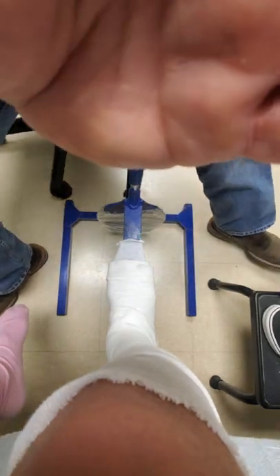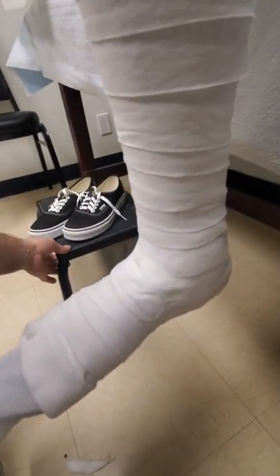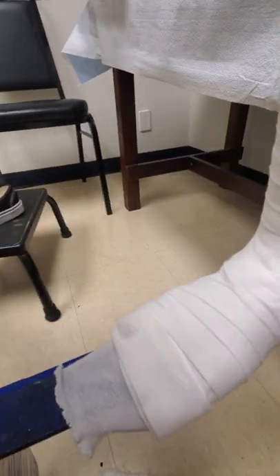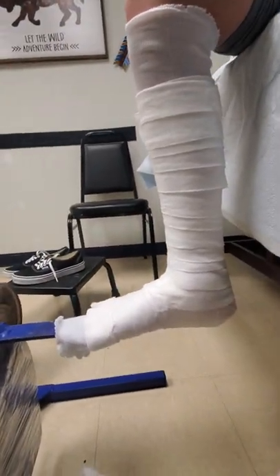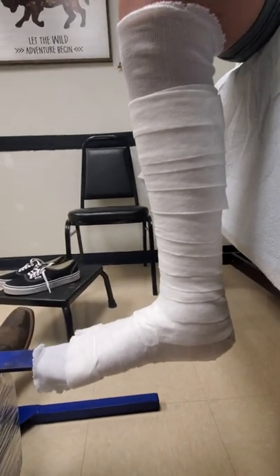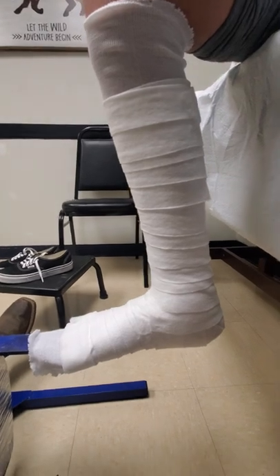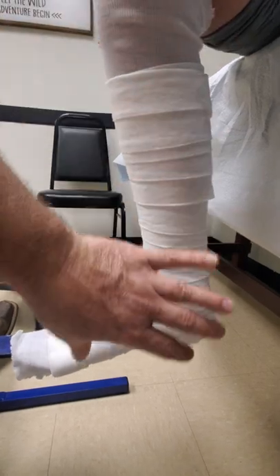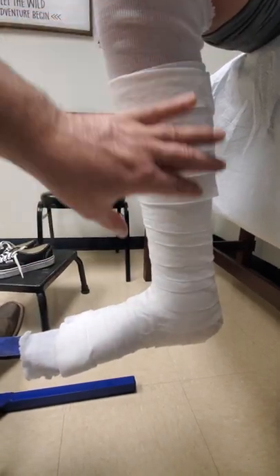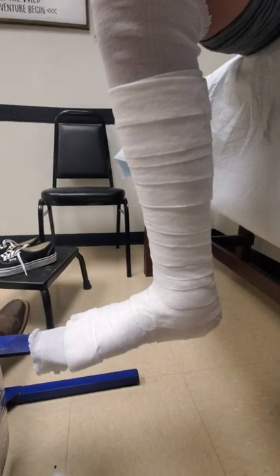I'm going to borrow the camera for a second to show the angle, which hasn't moved at all. We're pretty much there. I'm going to have the patient move their knee a little more forward — right there, that's perfect. I want to try to get one or two degrees more than 90 since this is not an actual injured patient, so this will be a really nice weight-bearing cast. Now we'll proceed to the fiberglass.